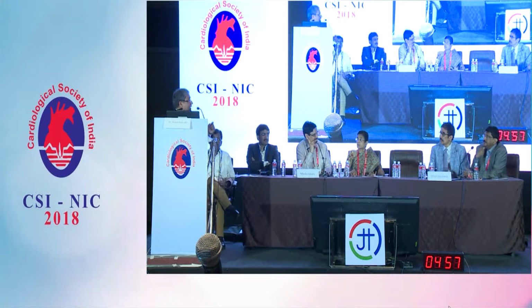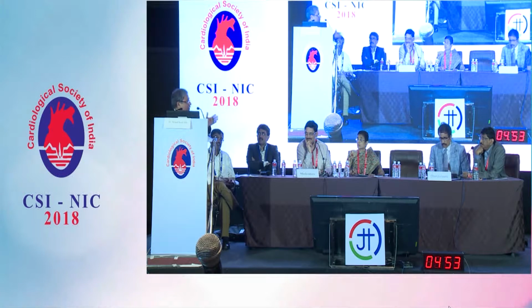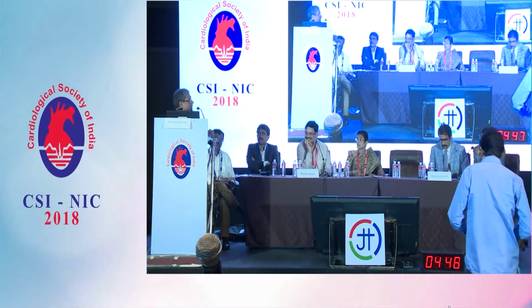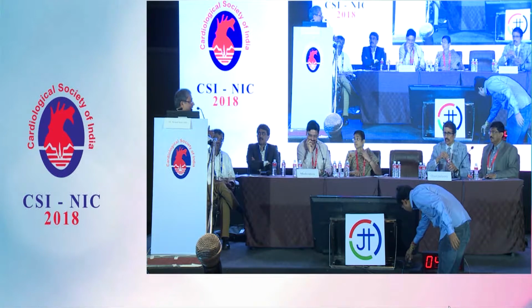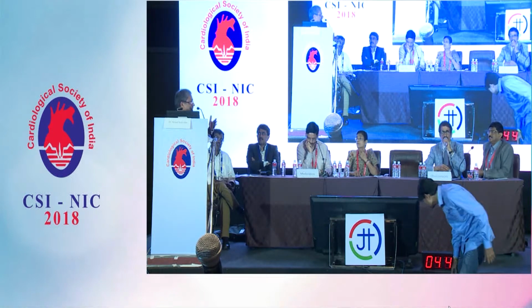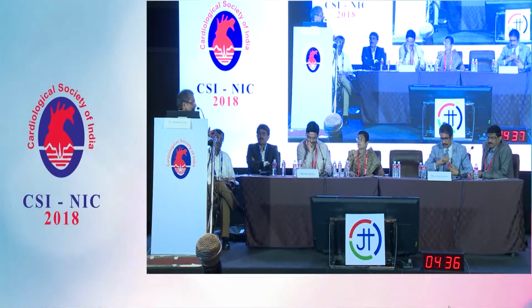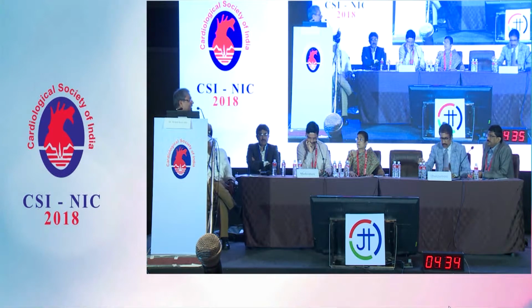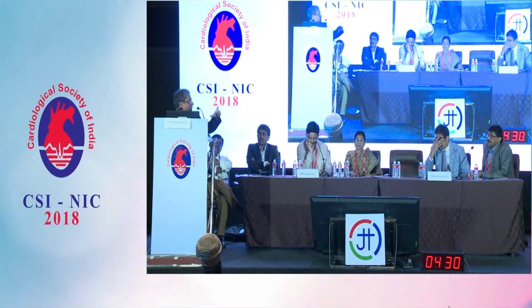All these possibilities were thought of, and regarding the migration of the thrombus, we also thought that this kind of thing might happen even in this case. That's why I put another catheter, the guide wire, in the circumflex as well, and thought that we could come out easily. But somehow it was not going easily, taking out a lot of adrenaline from ourselves, and then we thought that let us put this stent directly after finding out the length.